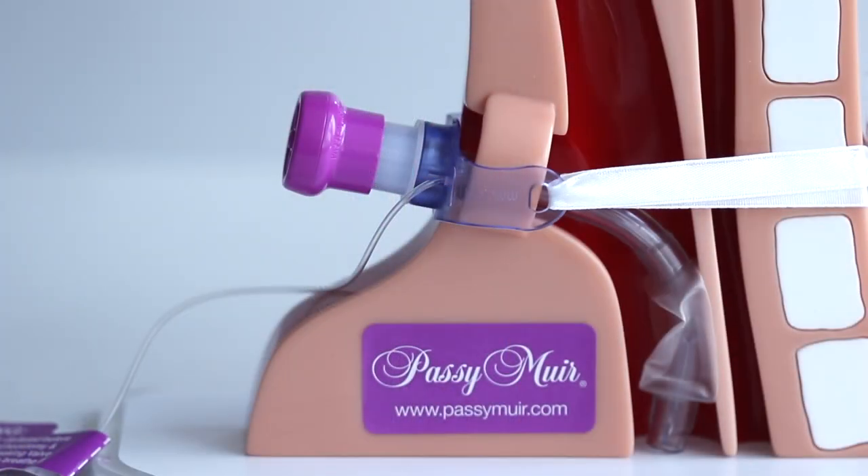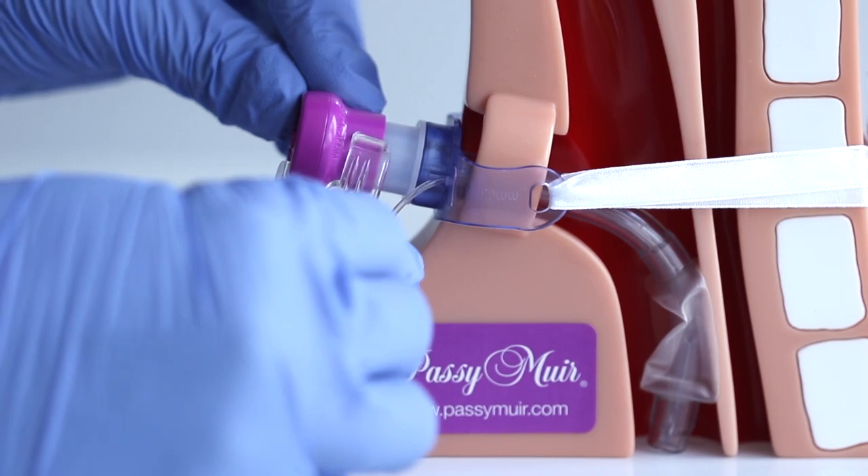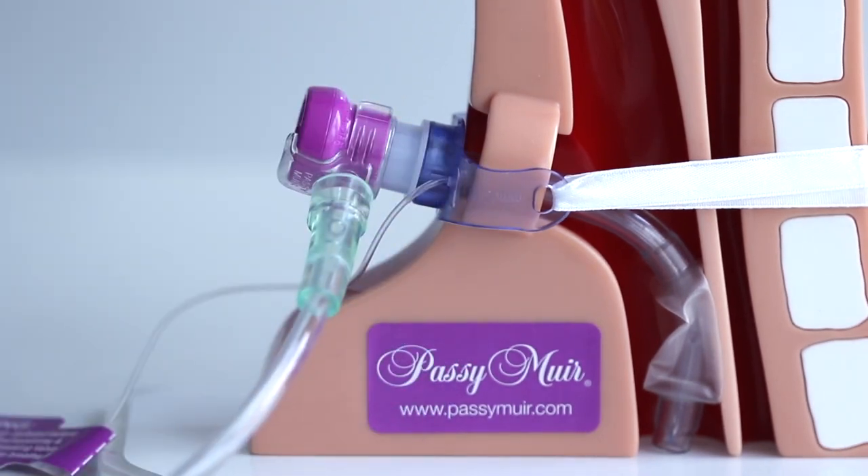To attach the oxygen adapter to the valve, place it onto the side of the valve opposite the inlet used for the PMV-Secure. Slip it into place with the C-shaped part of the adapter pushed into the lower portion of the valve and the small curved portion of the adapter seated on the face of the valve.